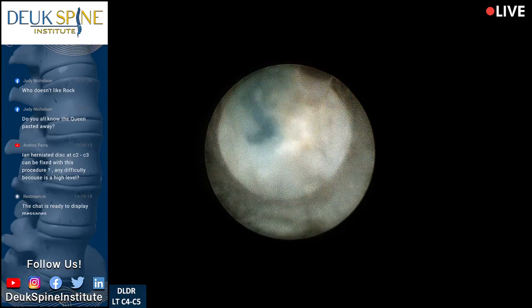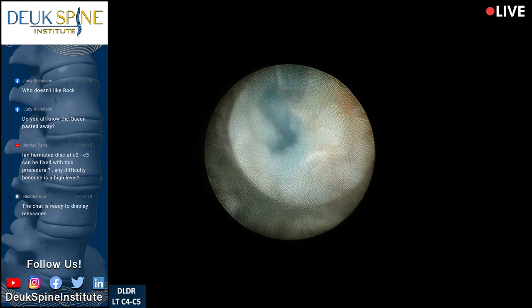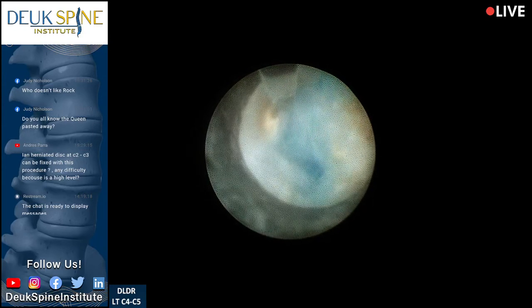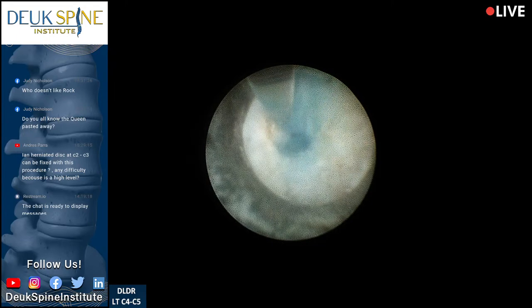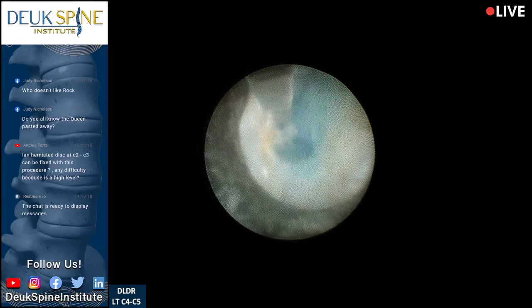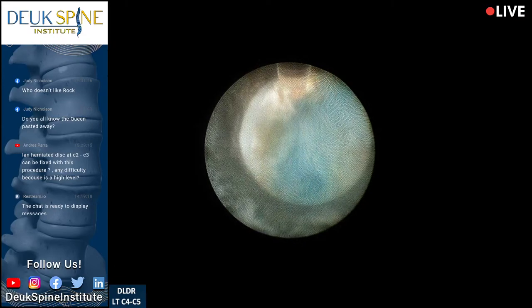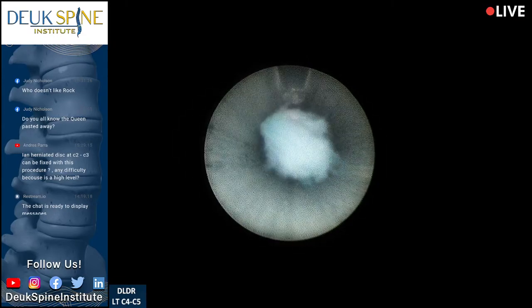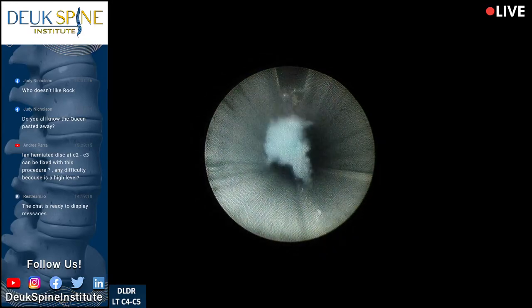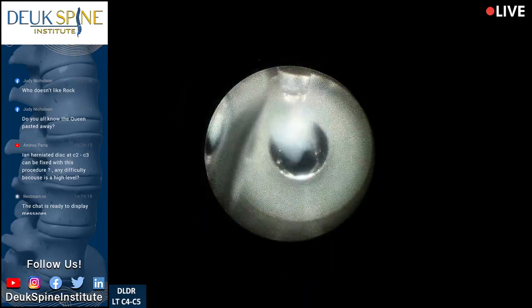That is a big tear — a huge tear in the back of this disc. I'm surprised I didn't see it that big on the MRI. That's why you don't go based on MRIs ever — you go based on people's symptoms and what they're experiencing. There's another piece that came out — we call that a reverse herniation. We coined that at Deuk Spine — the first people in the world to call it a reverse herniation.